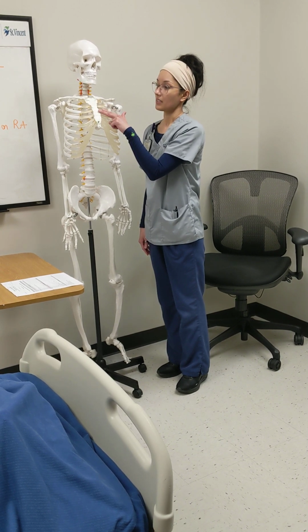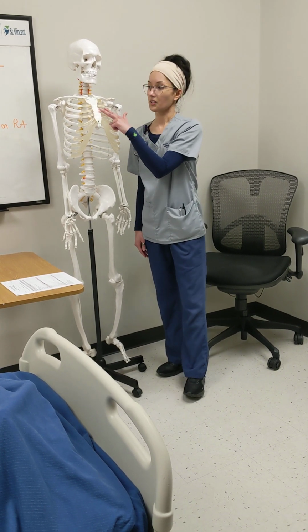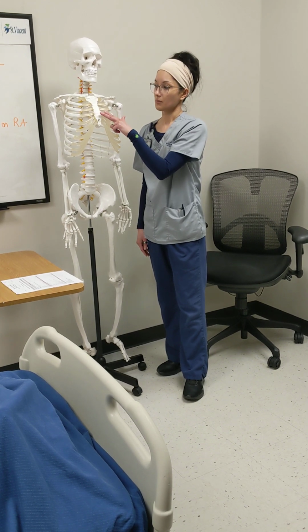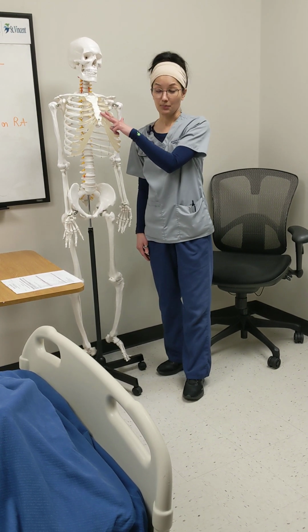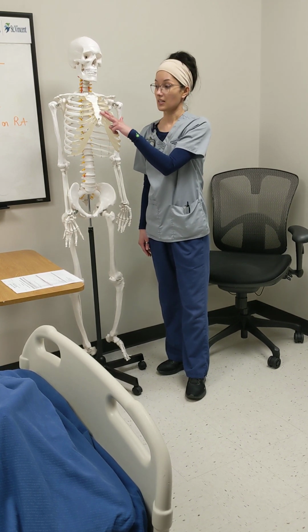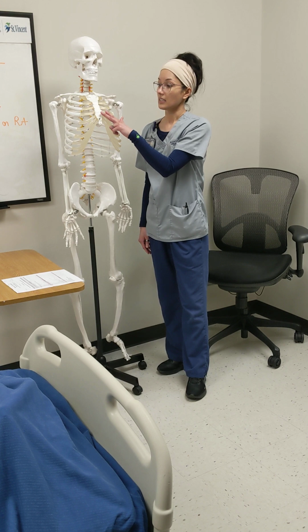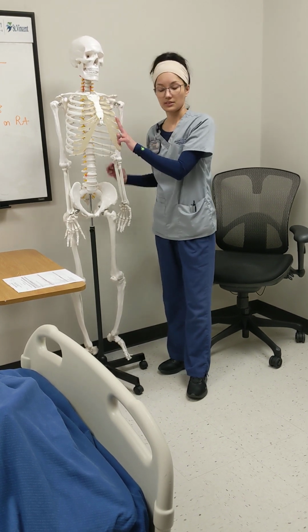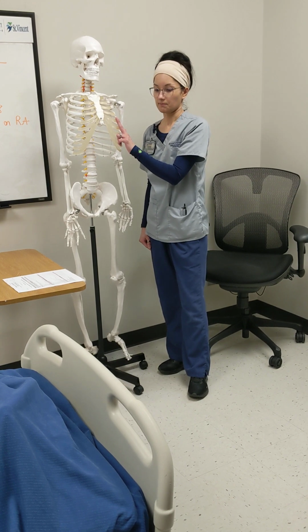I'll come down along the left sternal border, third intercostal space, Erb's point, and then fourth intercostal space, left sternal border, to hear the tricuspid valve sounds. And then lastly, at the fifth intercostal space, midclavicular, I would listen to the mitral valve sounds.